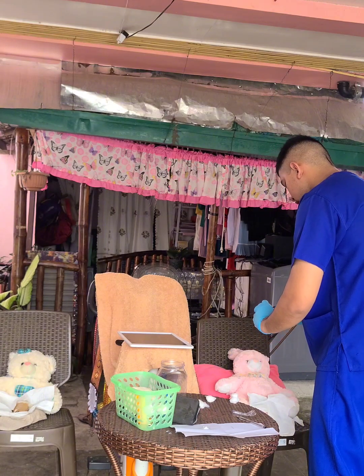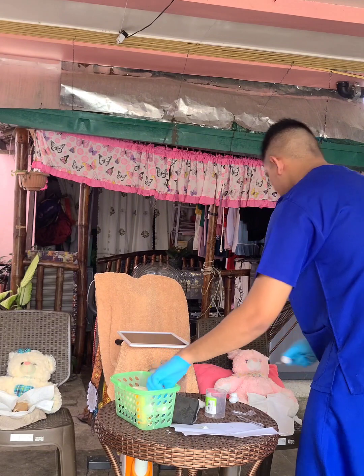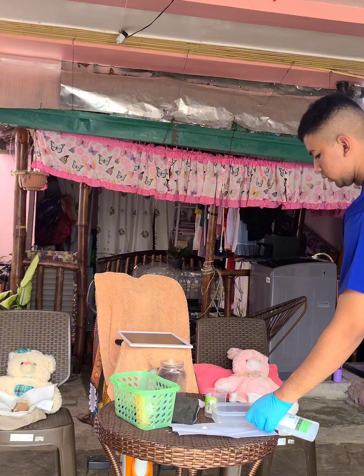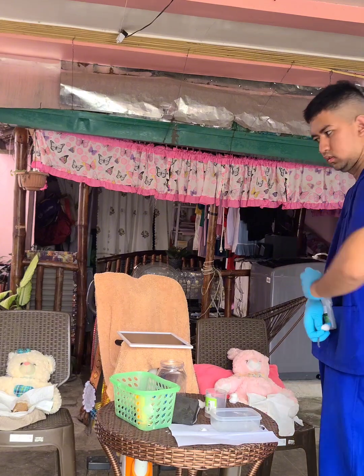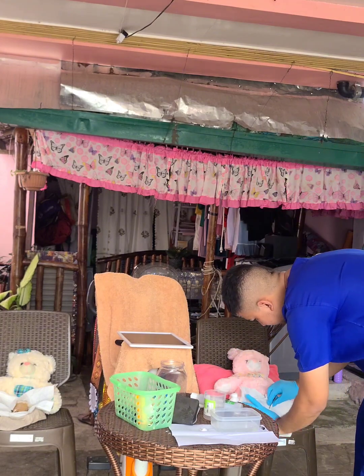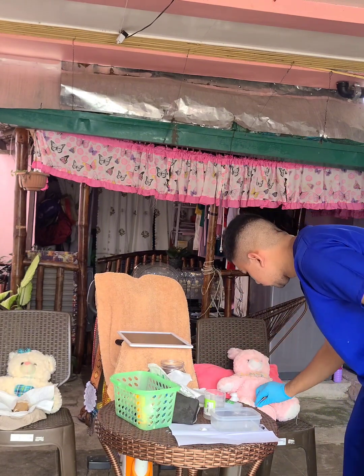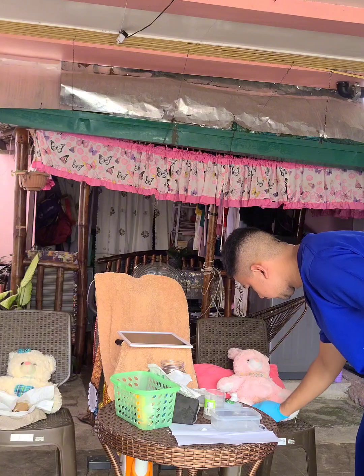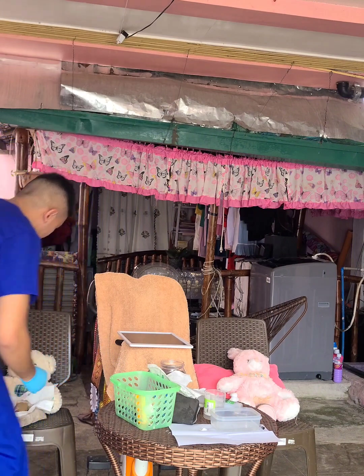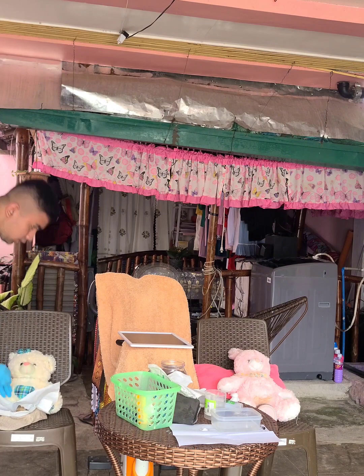So this time, we will use alcohol. Work with one water. Alcohol first, then this warm water. Around the patient's labia, and then the legs, between the thighs, and same goes for around the patient's penis and the thighs.